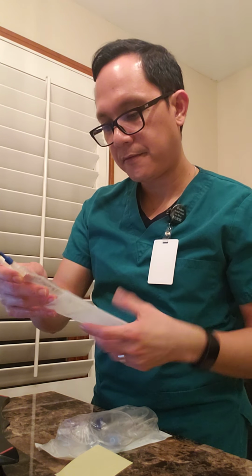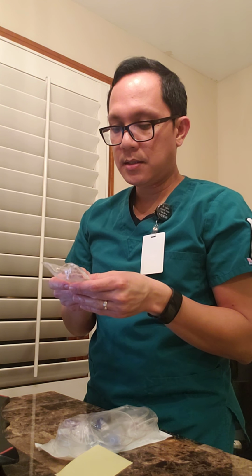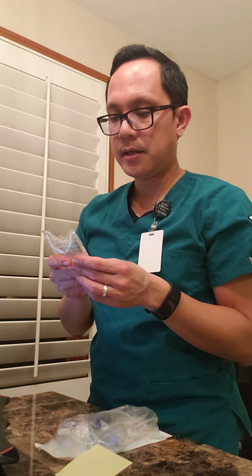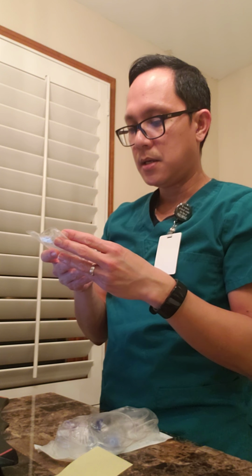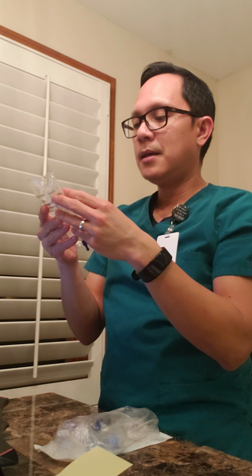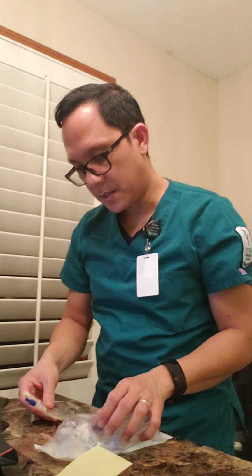After that, I'm going to take the IV bag off the packaging. I'm going to squeeze the IV bag gently just to make sure it doesn't have any tears or leaks. And I'm also going to check the expiration date of the IV solution. At the same time, I'm also going to be checking for color, clarity, and the expiration date.